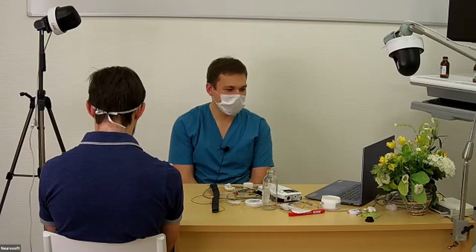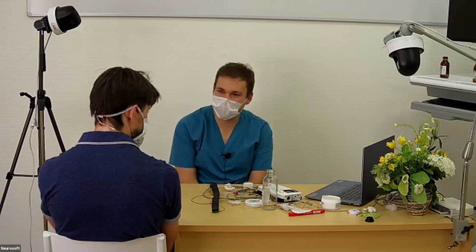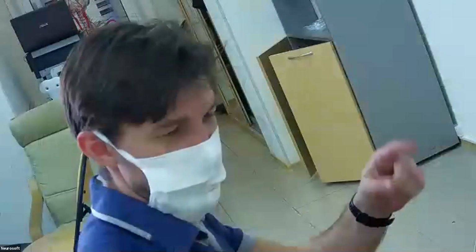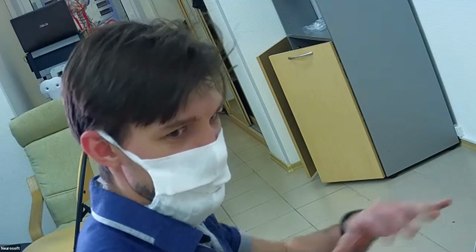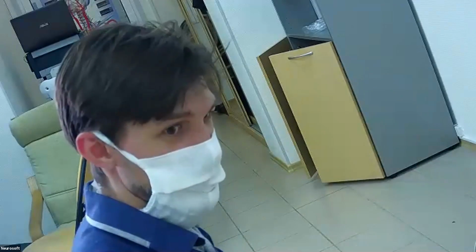I can answer. Do you hear me, colleagues? I was looking at that screen and controlling the effect which I make there, and that's why maybe I influenced the result somehow. To avoid this influence, Evgeny switched me off from this process.